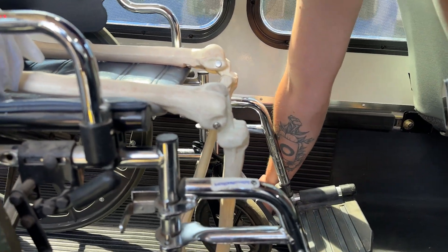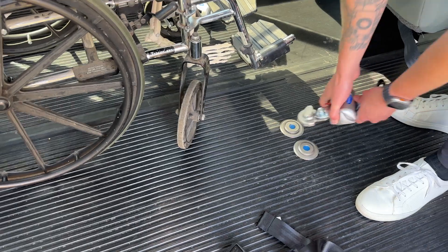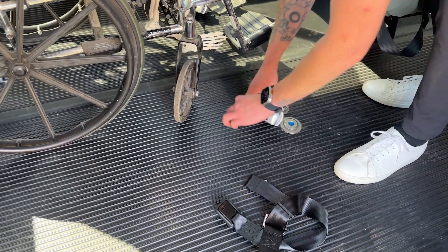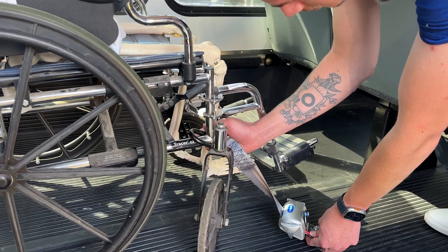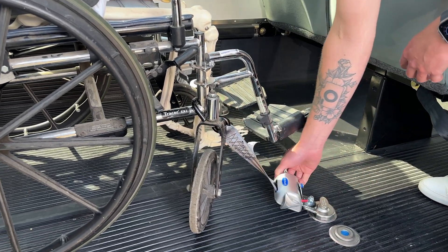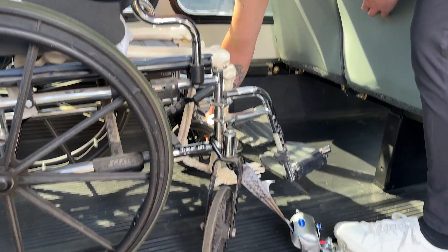We'll snug it up and do the same thing for the right side front position. Swivel it around, press the red lever, pull out and secure from the inside to that welded member, then snug it up. Once you've got it fully snugged on all four corners, we can do a brake test.